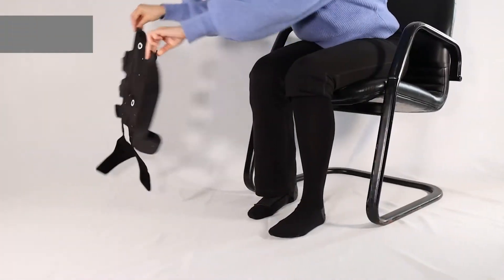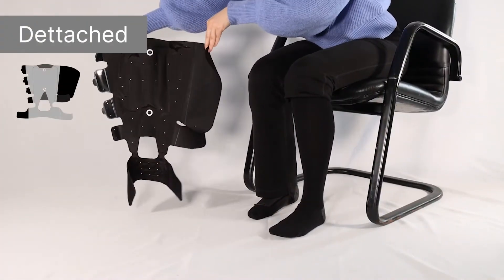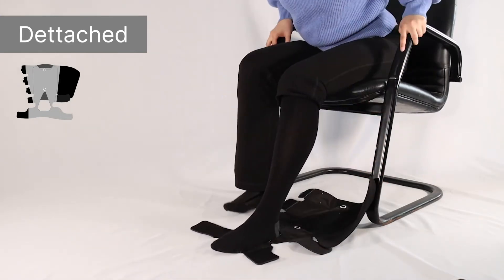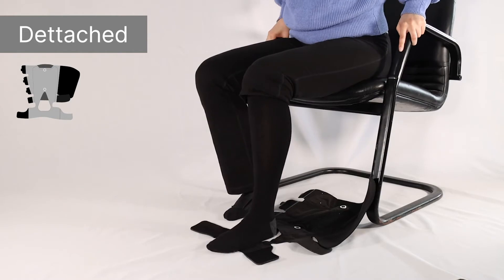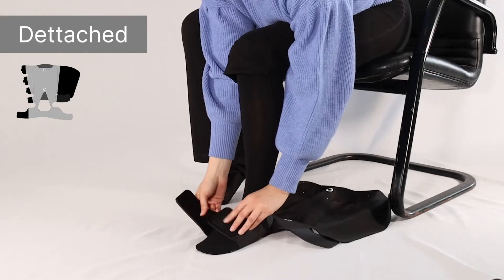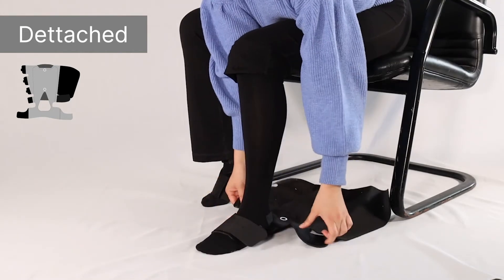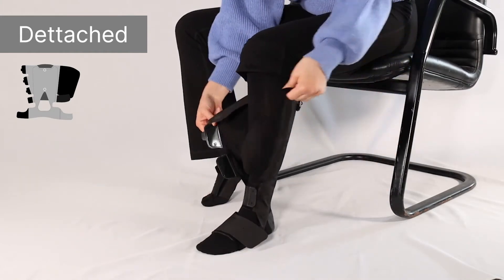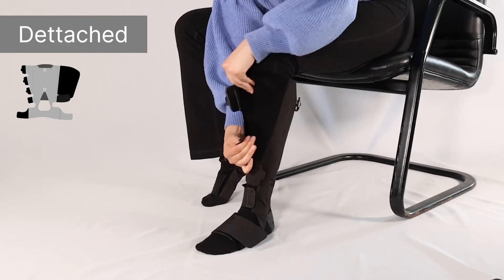Or, the undersock can be detached and AeroWrap can be applied over the liner of your choice. To orient AeroWrap, place your heel comfortably in the heel opening on the sleeve. Begin securing the strap starting with the foot strap, then the ankle strap, and continue up the leg adjusting where needed for a snug and comfortable fit.